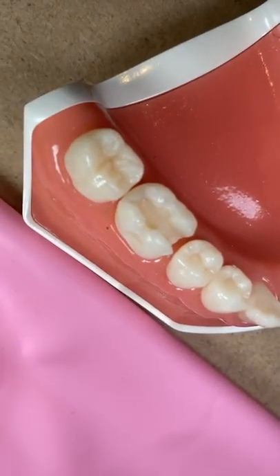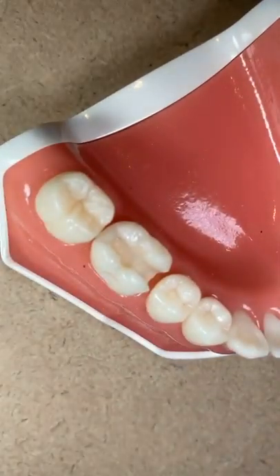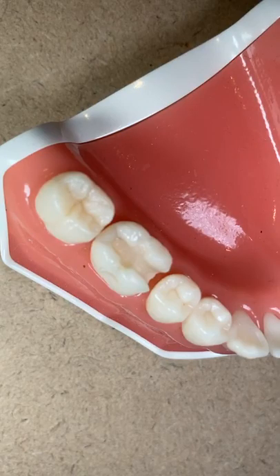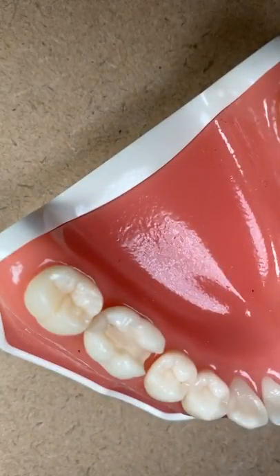Okay, turn off the command. This is the pink rubber dam that I use from Kerr Dam. The very first time I will put the frame on, just like usual. Put the rubber first, then I create a hole, and then I create the custom template. This is the easiest way to place rubber dam.